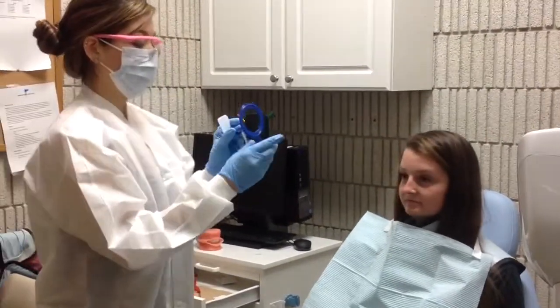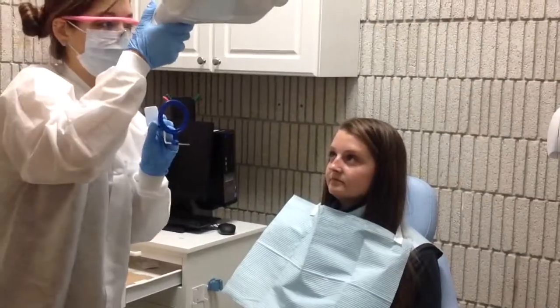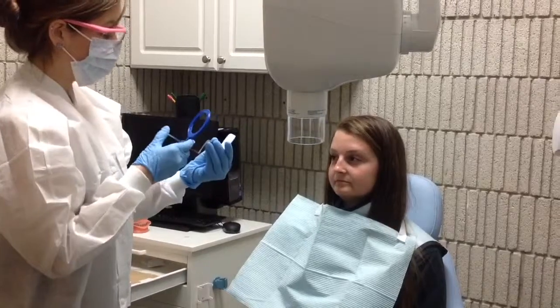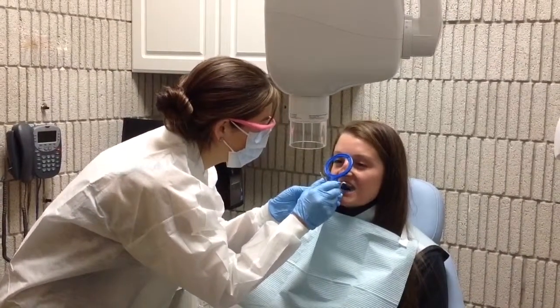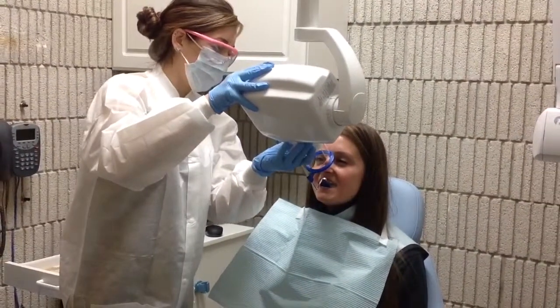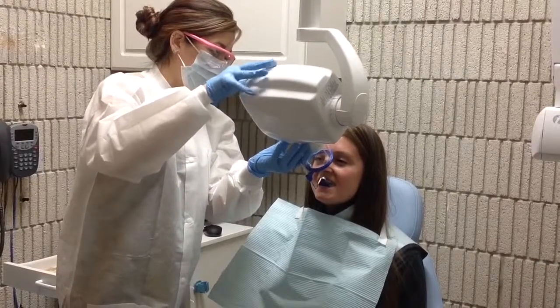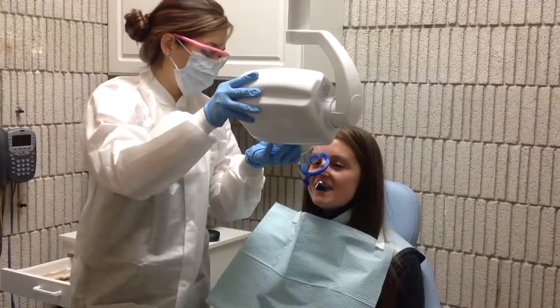So I'm going to have you, again, it's going to go just like this, and my camera is going to point right at your nose. Okay. So I'm going to have you open nice and big, and bite down. Perfect. I'm going to have you stay super still. I'm going to run out of the room. And when you hear the beep, you can slowly open, okay?